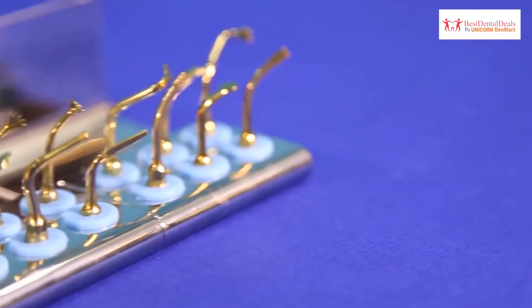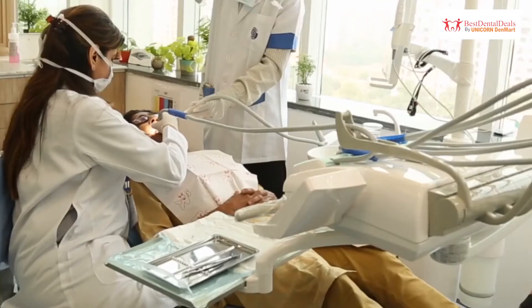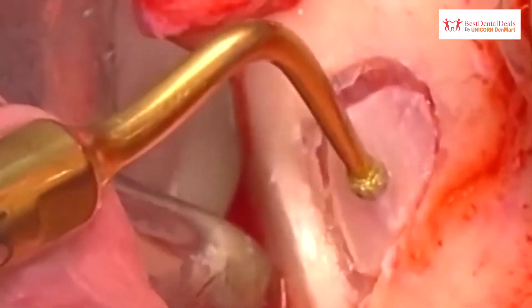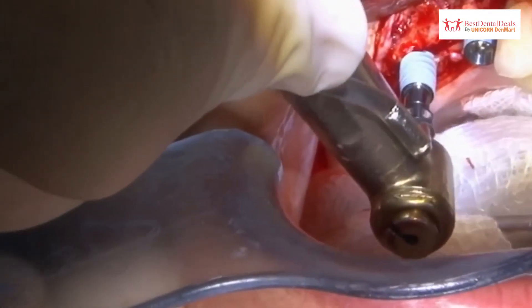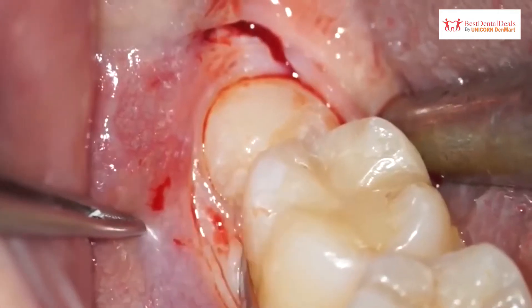Surgery X offers 14 versatile tips to the clinician for performing multiple procedures, including direct sinus lift, indirect sinus lift, crest splitting, osteotomy, micrometric bone cutting, extraction, impaction, and many more.